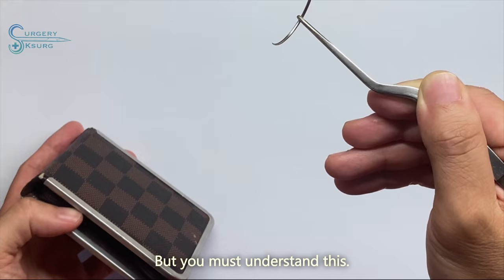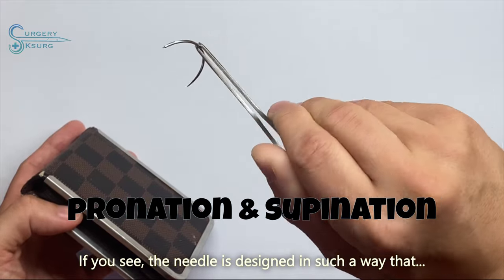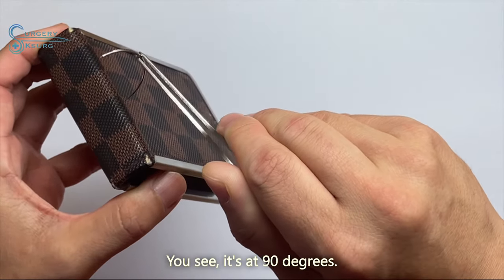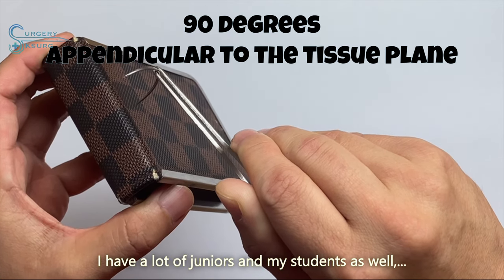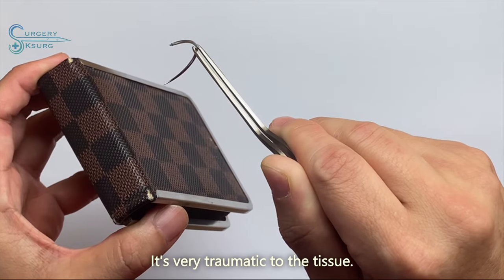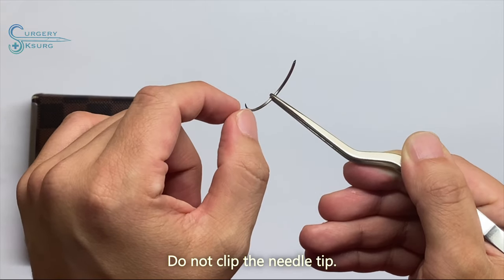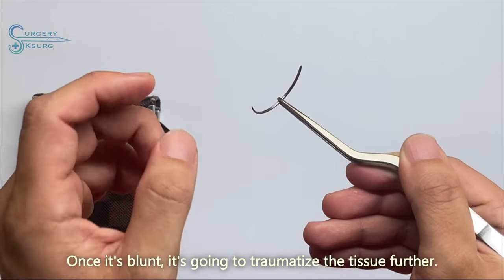But you must understand this: your wrist has this movement, pronation and supination. And as you see, the needle is designed in such a way that you use this movement. Let's say this is a tissue. When you want to drive the needle in, you see, 90 degrees. I have a lot of juniors and students as well. They don't do 90 degrees, they do something like this. It's not going to drive through the tissue. It's very traumatic to the tissue. So that's why you must have 90 degrees and pronate, supinate out. Pronate, supinate out. And of course, the most important thing: do not clip the needle tip. Once you clip the needle tip it is blunt, and once it's blunt, it's going to traumatize the tissue further.